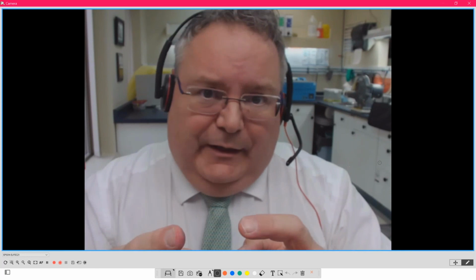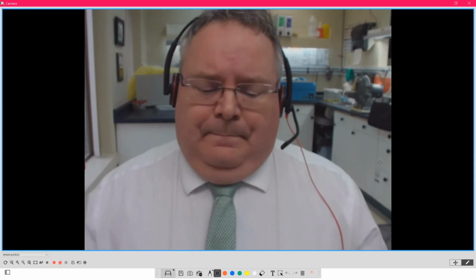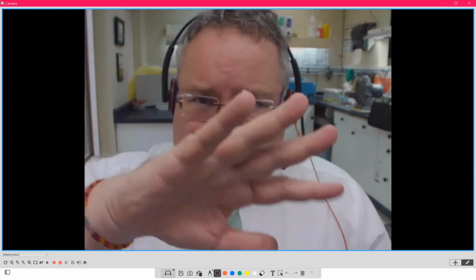But what does that mean? It's a smaller cusp, but I'll get a little bit more freedom, but it's still a 3-point contact. It still sits in there. Everything's still the same, as I wanted to show you that. So it allows me that flexibility. It still looks aesthetically good to the patient because that doesn't change. The emergence profile doesn't change.